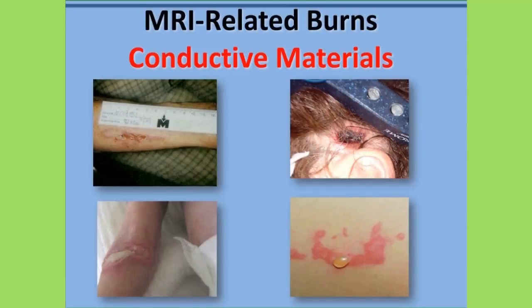Of note is that excessive heating and burn injuries can occur for certain implants and devices, even when the scanner is operating within recommended SAR levels for RF power deposition. Implants or devices that have an elongated shape or form a closed loop of a certain diameter may especially present increased hazards for burns in patients undergoing MRI exams.